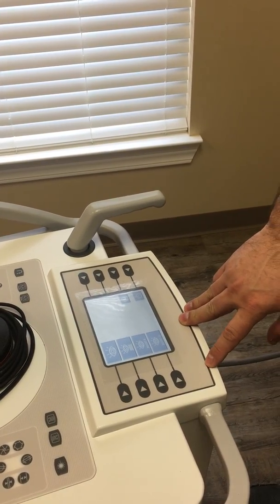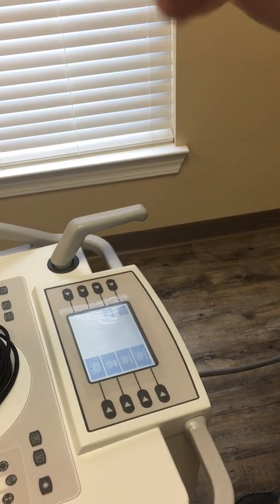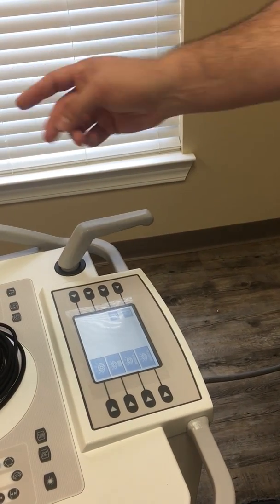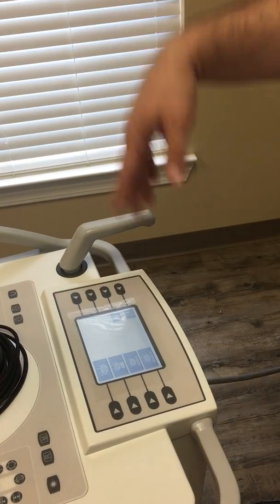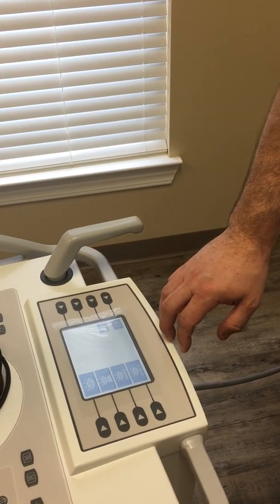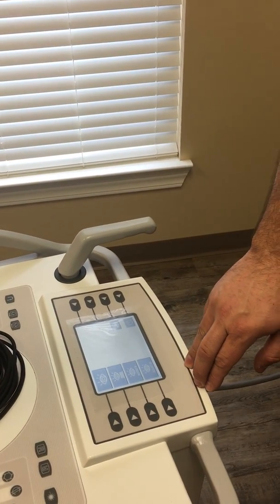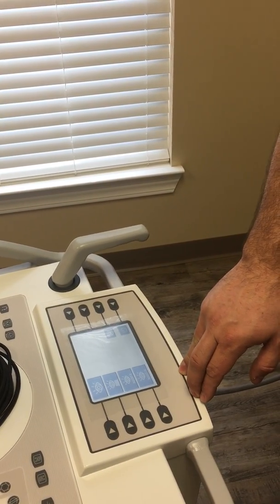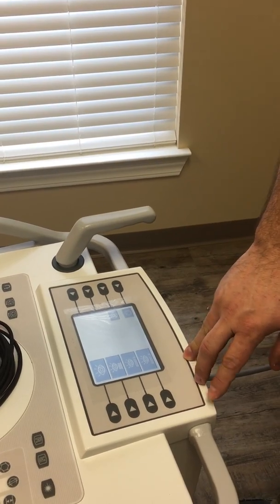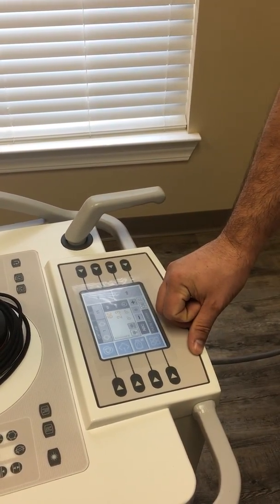Just for guidance. Yeah, to make sure he wants to do a comparison of what he's working on. Nah, I mean, let's say he takes a picture to see what his positioning is, maybe, and then doesn't save it. No, he never saves. I've not done it back here with him, so usually it's always Shannon. Never saves anything. It's just to see if the needle's in the right spot or whatever.